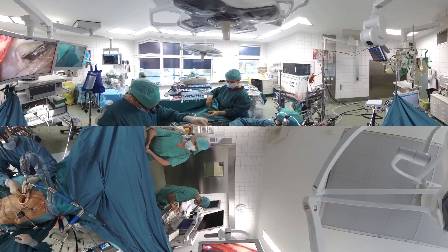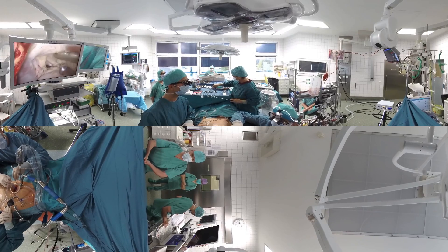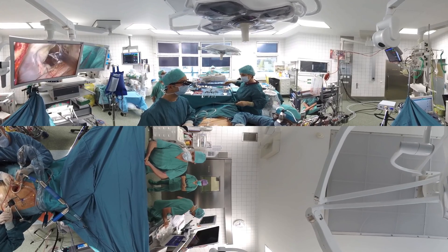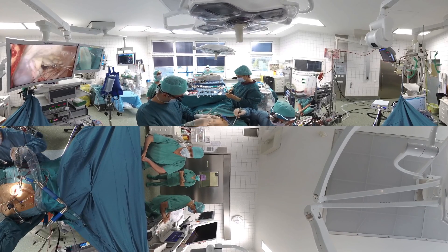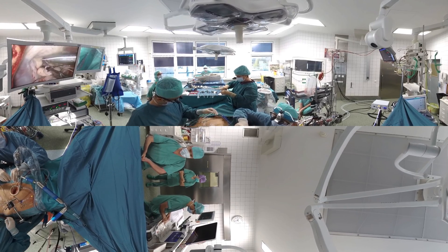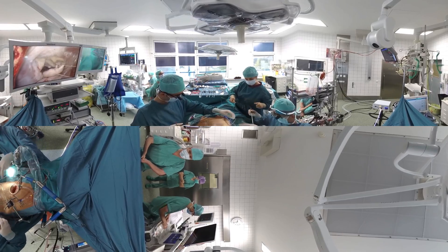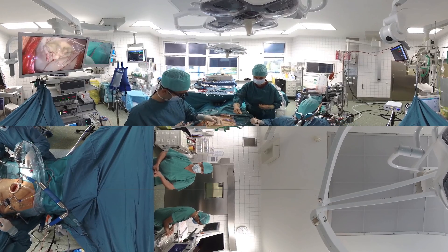A Gore-Tex suture with several loops of measured length are attached to the papillary muscle. Proper placement and positioning of the loops on the papillary muscle, which sits below the mitral valve, are confirmed under direct vision. Each of the Gore-Tex loops are then attached with a separate Gore-Tex suture to that segment of the mitral valve leaflet that is involved in the disease process. Special extended and narrow surgical instruments are required in order to work through the small incision.